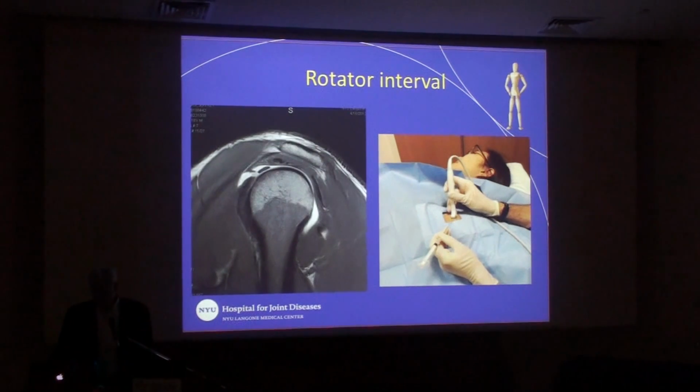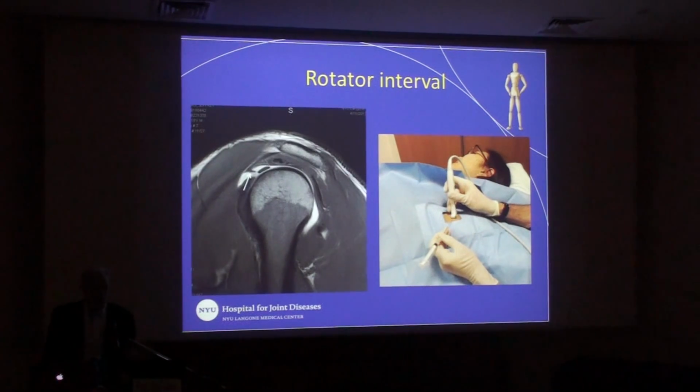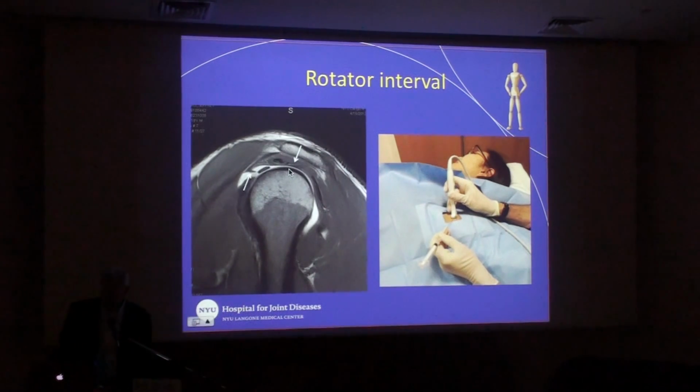So we have the biceps tendon as indicated on the sagittal MR over here, and we have two ligamentous structures, one overlying it and one that goes deep to the tendon. This is portions of the coracohumeral ligament, as well as a more deep portion, which is the superior glenohumeral ligament, indicated by the arrow here. That's the coracohumeral ligament, that has a deep component that goes deep to the rotator cuff tendons. And this is what this would look like on an ultrasound.